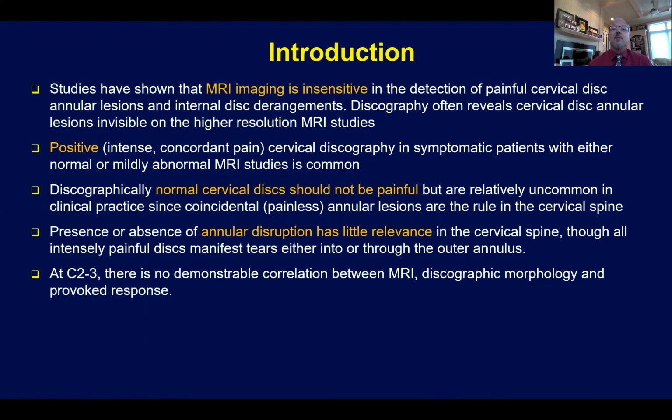Some studies have shown that MRI imaging is insensitive in the detection of painful cervical annular disc lesions as well as internal disc disruption. However, positive, meaning intense and concordant related pain, cervical discography in symptomatic patients can be demonstrated when patients either have normal or abnormal MRIs. That's a very common finding. Discography of normal discs should not be painful.